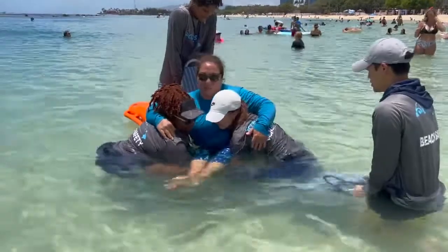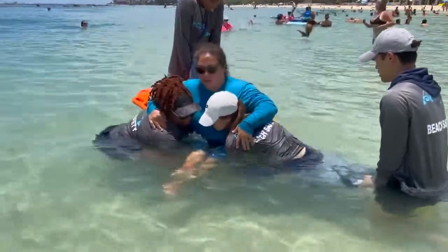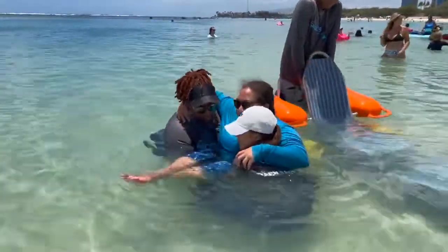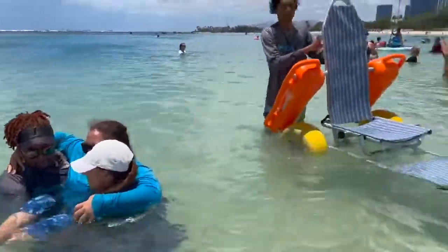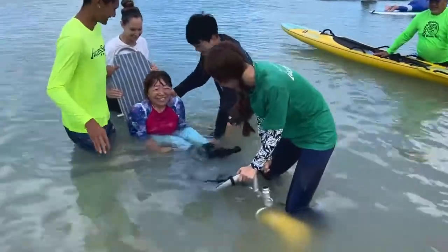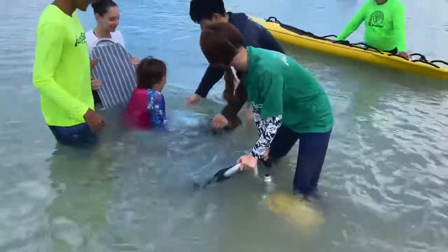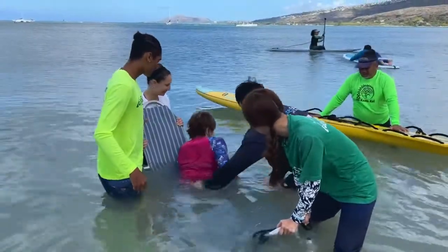Volunteers may assist the participant in moving out of the chair as needed. The amount of assistance the volunteers provide the participant when transferring in and out of the Mobi-chair is completely dependent on what the participant asks for. Some participants may want full assistance, and others may want to swim out on their own.